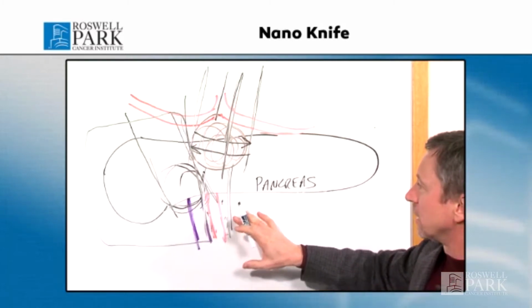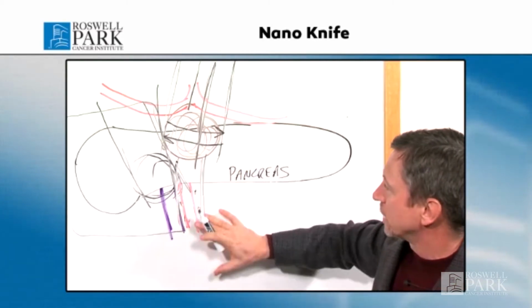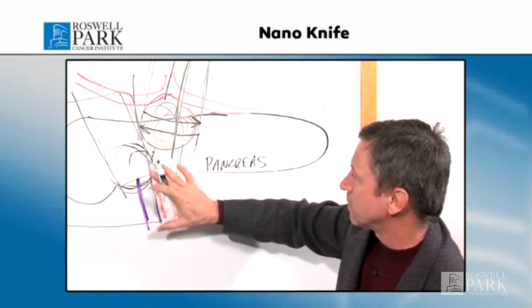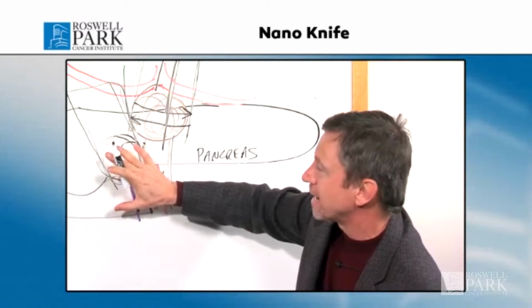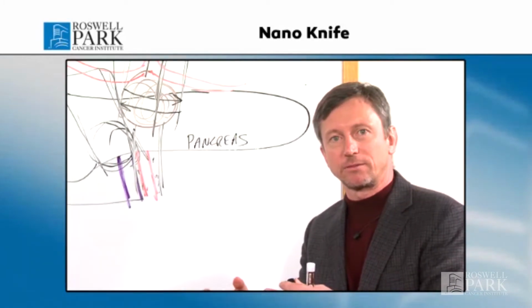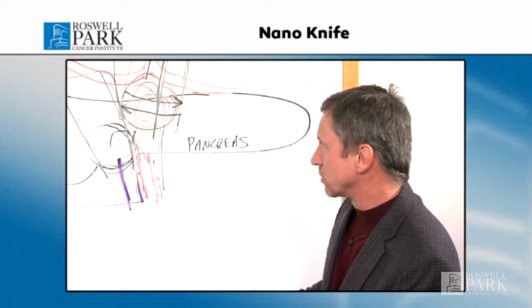We call that margin accentuation, where we actually try to kill any tumor that might be at the margin. So NanoKnife can be done in combination with removing the tumor, or it can be used where the tumor is actually left in place and the NanoKnife becomes the major treatment.